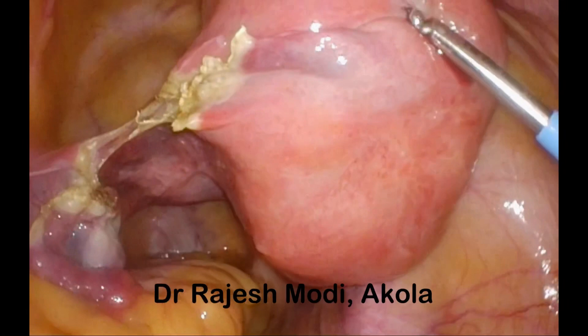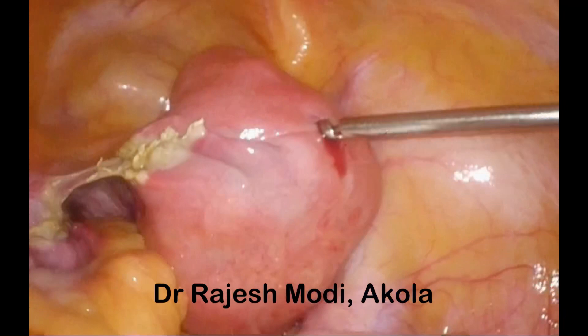This allows you to get a proper view for the surgical work. So do not pull the uterus up — lift the uterus up with the myoma screw.